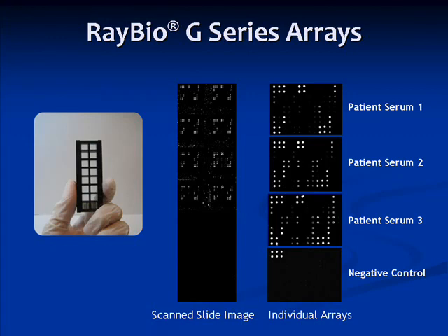Examples of the outputs from the glass slide arrays are presented here. 10 microliters of serum from three different patients were simultaneously analyzed for inflammatory markers.